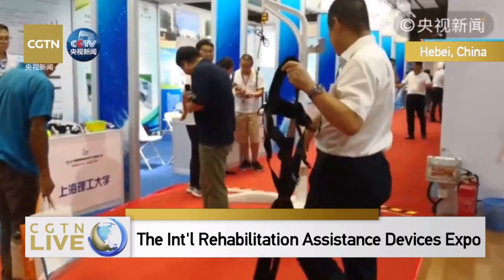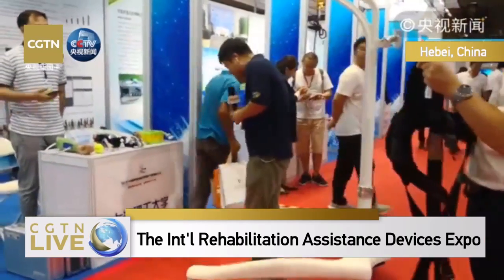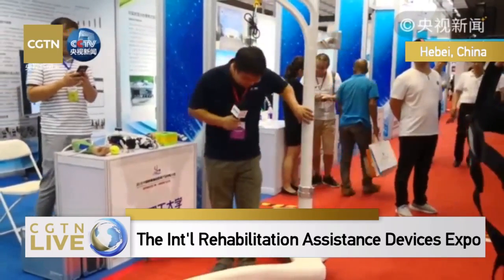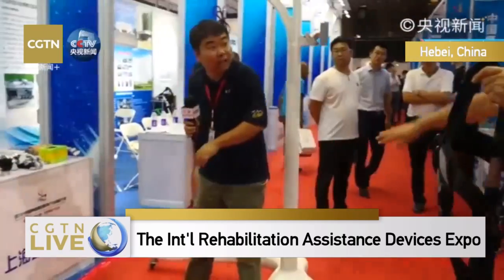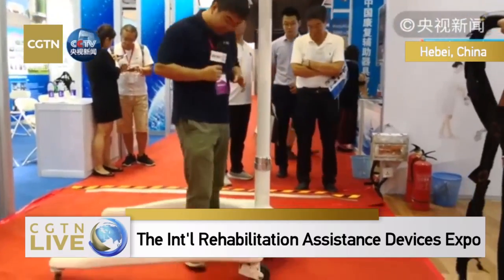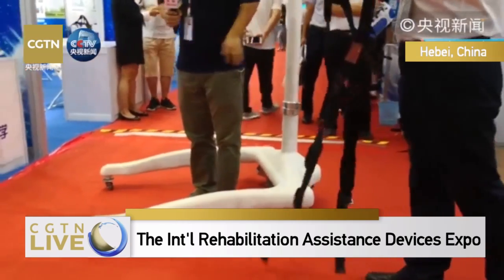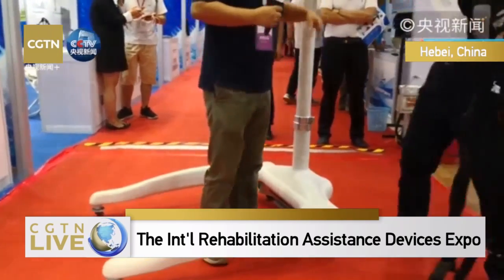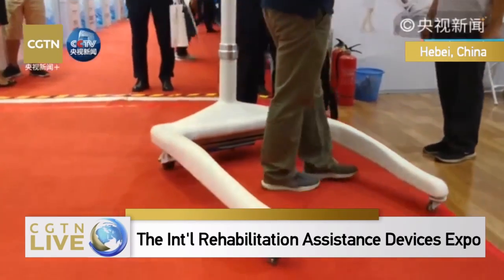I wasn't as proficient as our staff. I'm not very good at turning. You can also go backward. I can also try this.